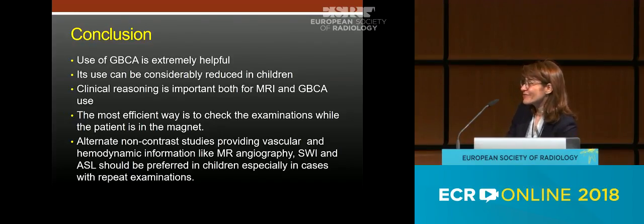And we should always try non-contrast studies first, especially on assessment of the vascular status of the tissue, and use TOF MR angiography.